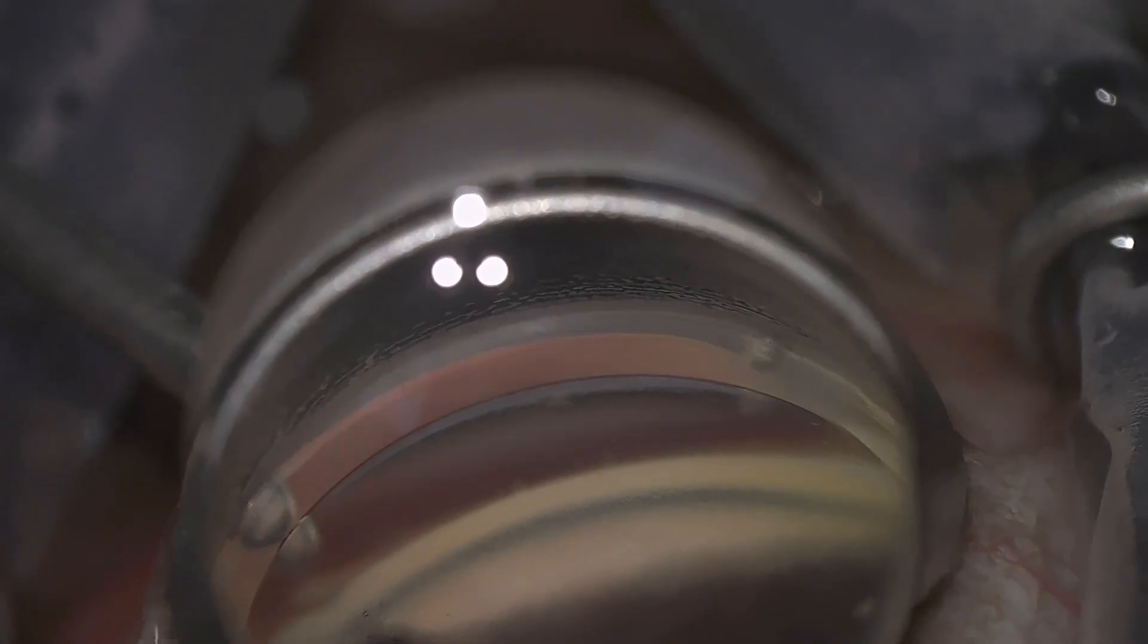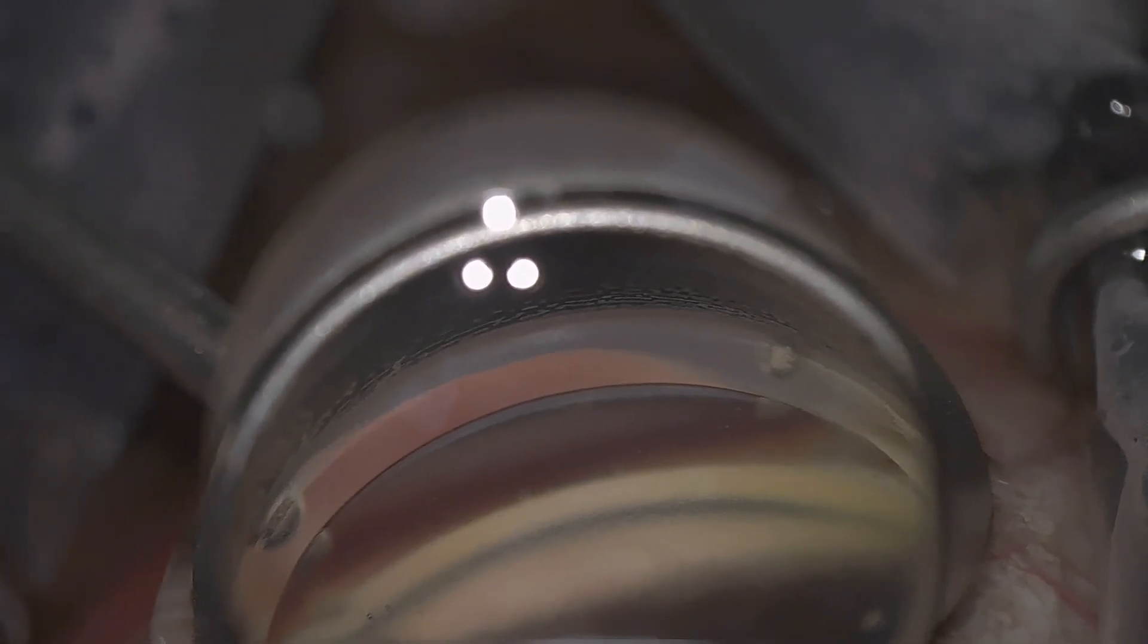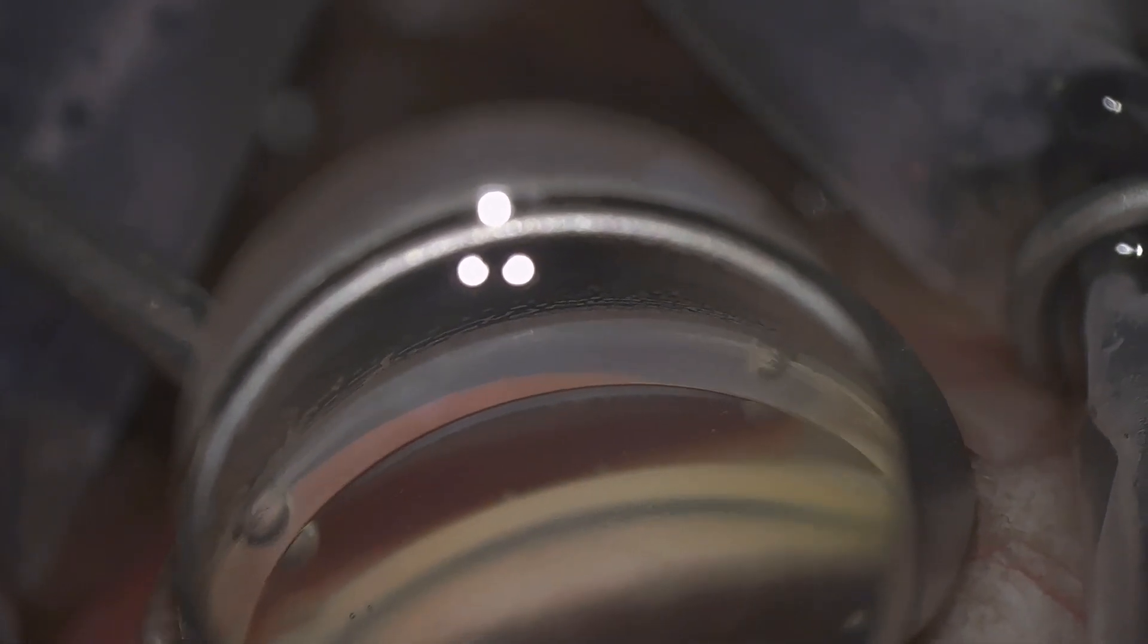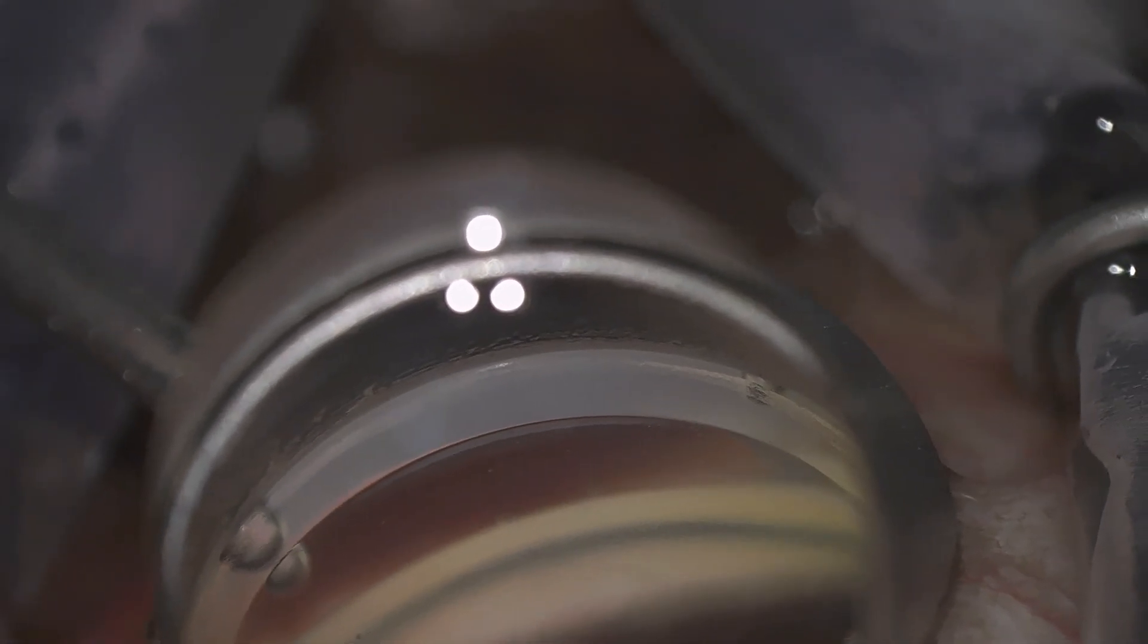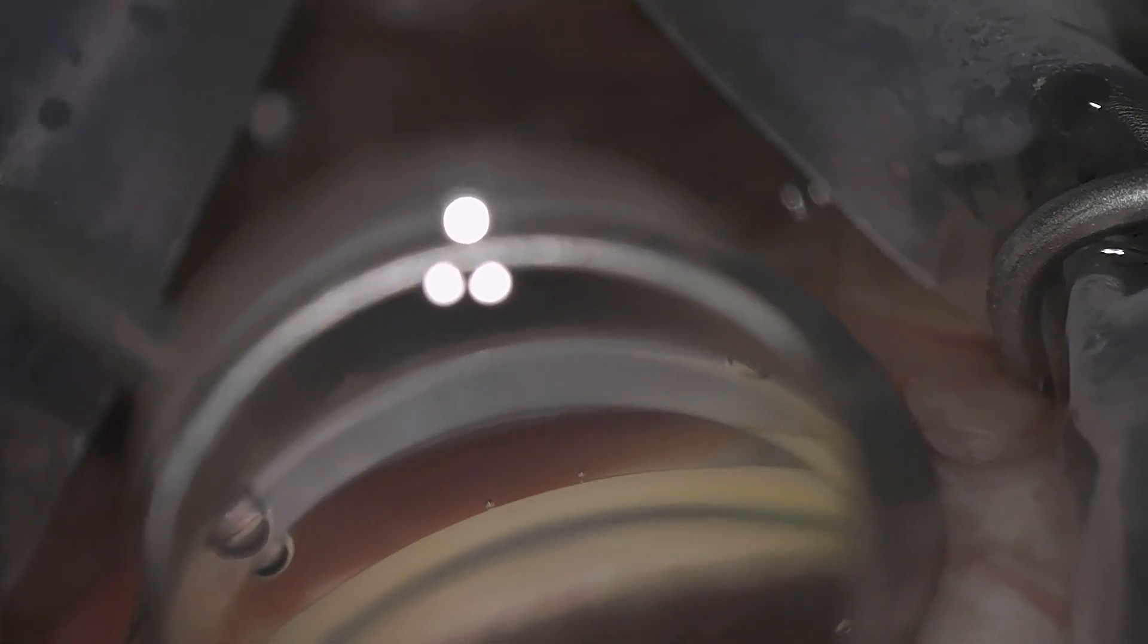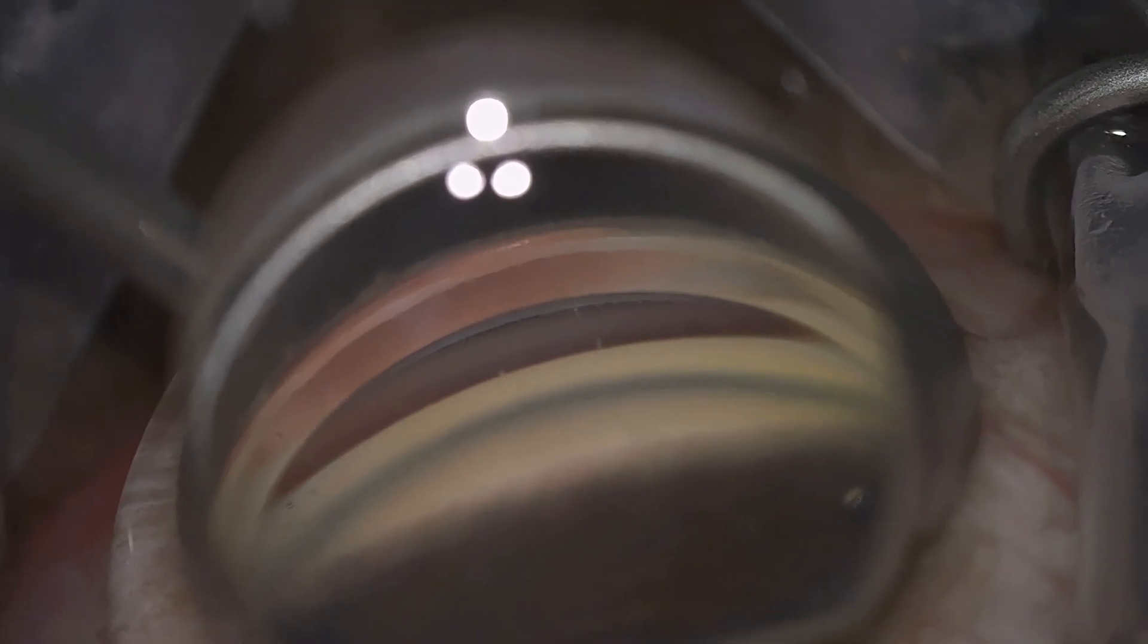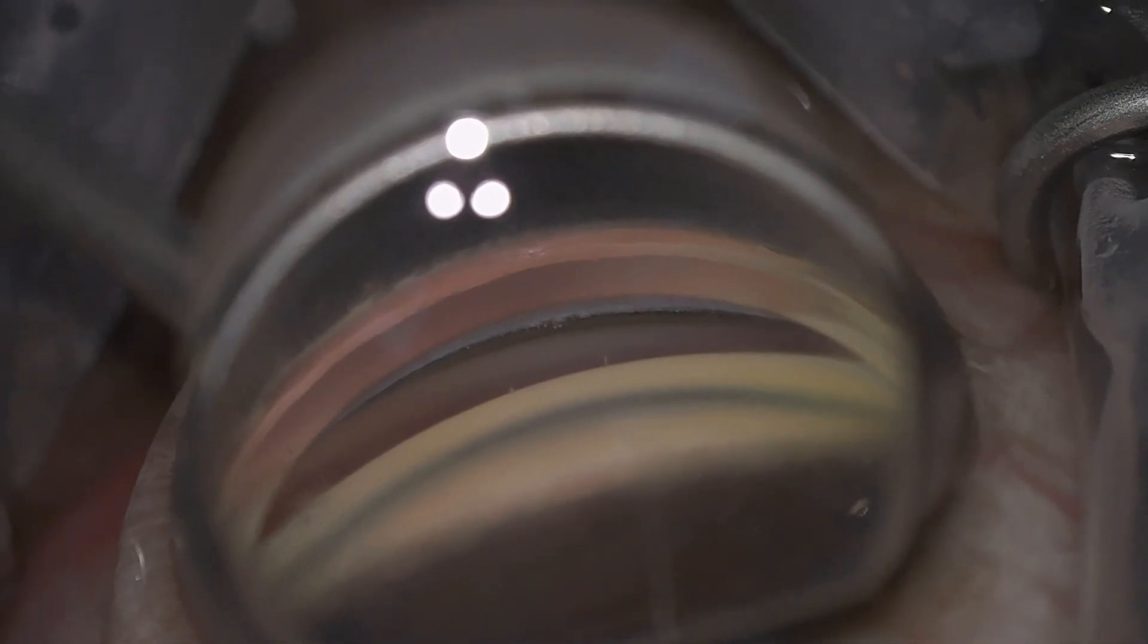And the main issue here really is that as you engage the trocar with the trabecular meshwork and you apply some pressure, it can distort the view. And really, view is key to being able to implant these stents accurately.